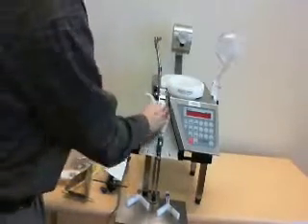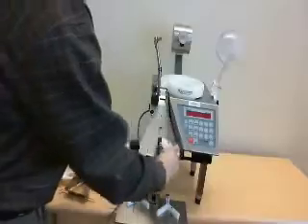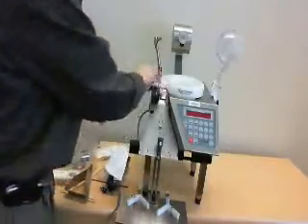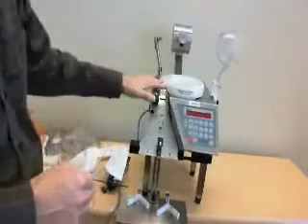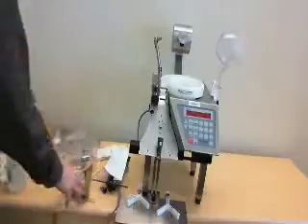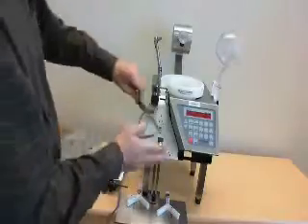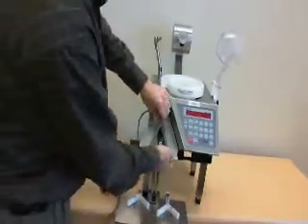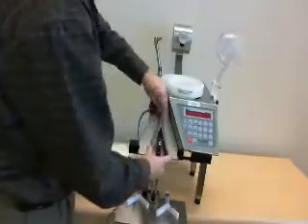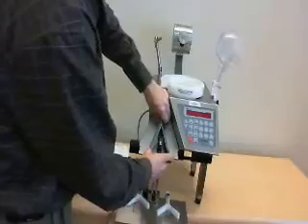At this point, all areas that have been in contact with medication dust, or potential for medication dust, have been cleaned. You can also clean the outside of the device as well. And now we'll reassemble in the same order that we disassembled. Take care to never force these tabs in. Gently finesse them in.